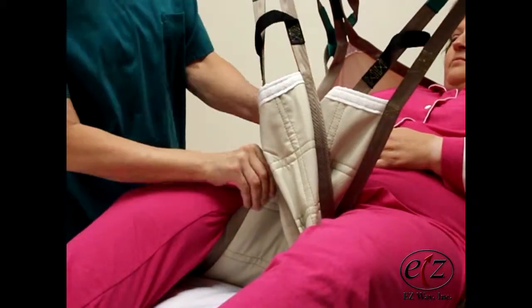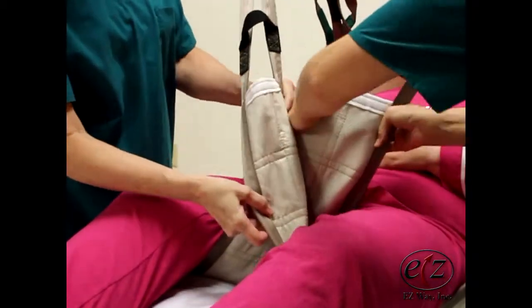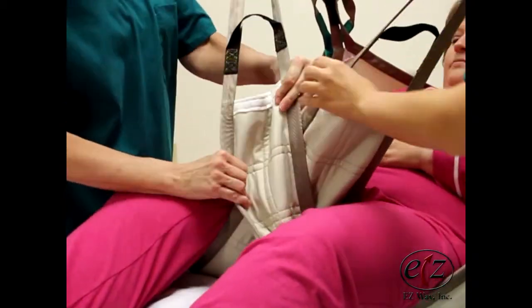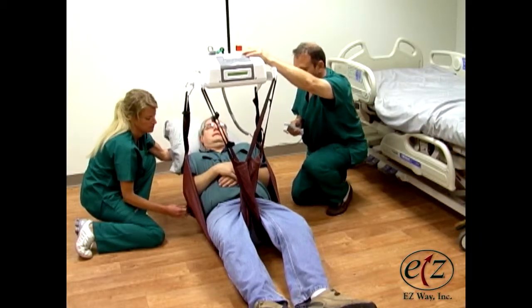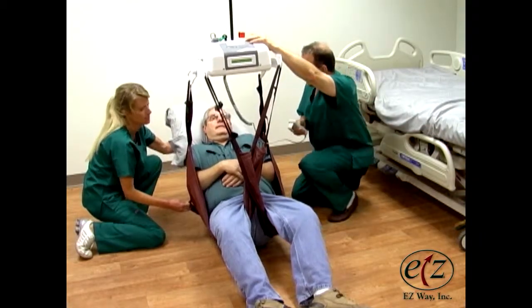If necessary, smooth sling legs under the patient's thighs with a slight tug on the outside seam of the sling legs. Lift the patient until they are high enough to clear the bed or chair they are being transferred to.